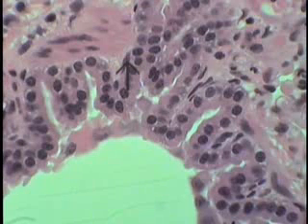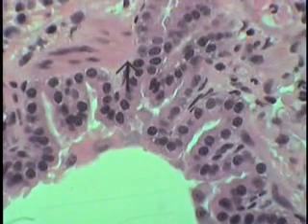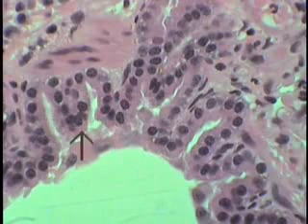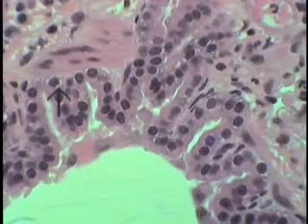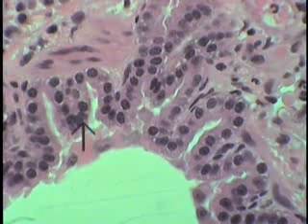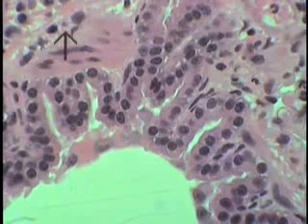That same bronchiole, as examined at low power in the previous section, showing in detail its lining epithelium. A simple columnar form that's getting fairly low. Not many cilia are observed, and no goblet cells are visible at this particular point in its subdivision, as we're nearing the terminal end of this conducting portion of the respiratory tree.